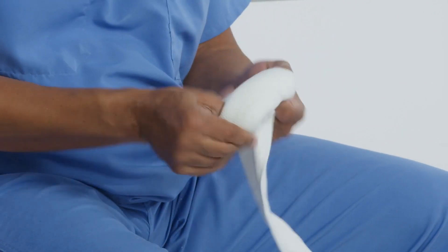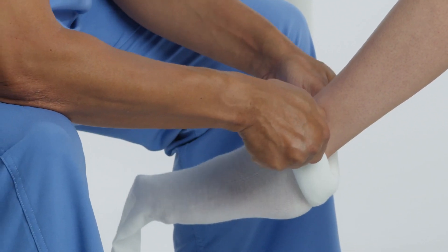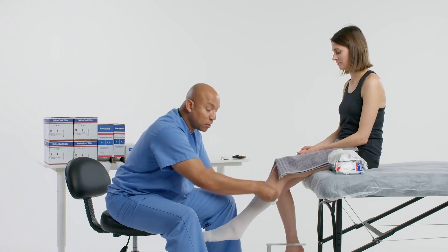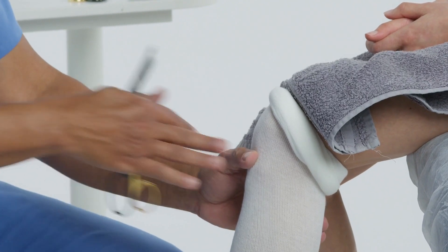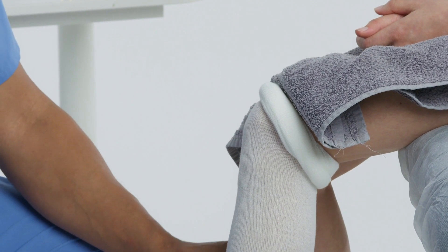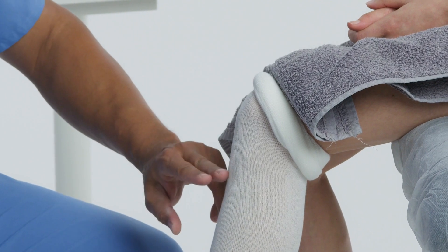If the fifth toe is enclosed, you might have to cut that out with the cast saw because that can be very irritating to the patient. Just like any fold when at 90 degrees, because that's the position the patient will be in, we're going to cut out the extra material there. Here's the patella, the tibia tuberosity, and that's where you can feel the little bouncing of the tendon. That is where we will stop our cast — one to two fingers' breadth below that bony prominence.